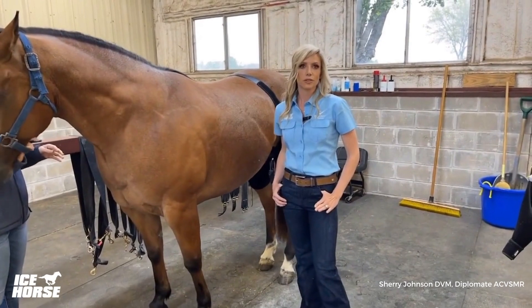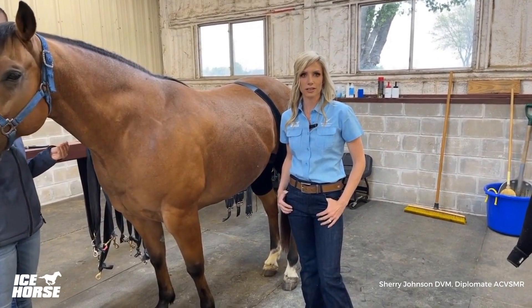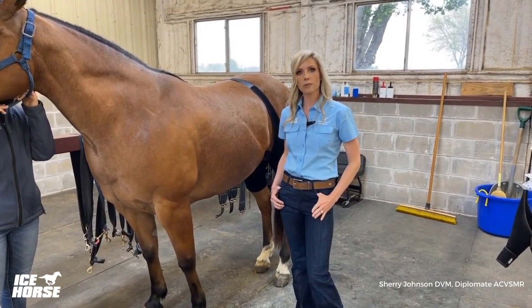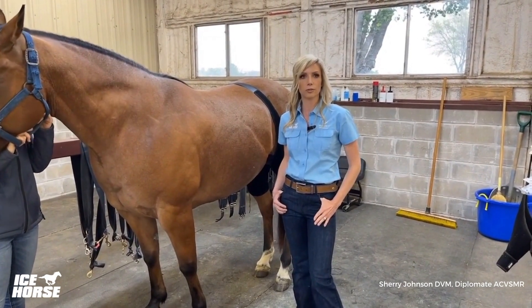Today, I'd like to discuss some pro tips and tricks for icing stifles in the equine athlete. Cryotherapy plays a major role in a lot of my rehab programs, and I'm using it mostly for pain modulation — helping the athletes feel more comfortable.